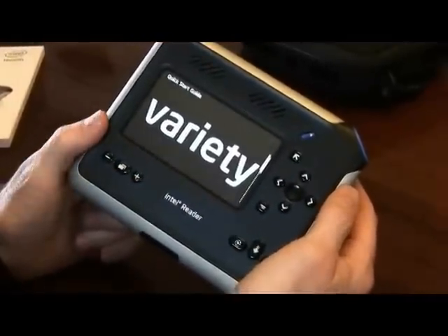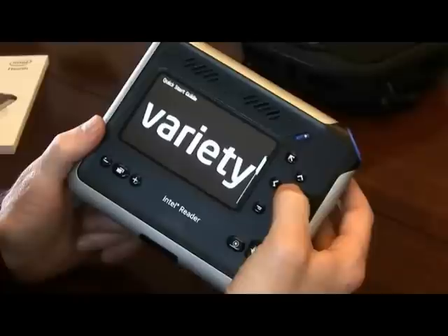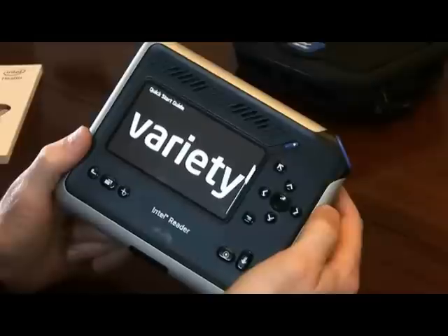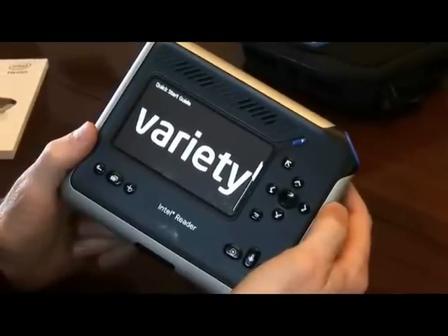You can even spell out a word by pressing the home key here and holding it down. For example, the word 'variety' will be spelled out letter by letter: V, A, R, I, E, T — variety.